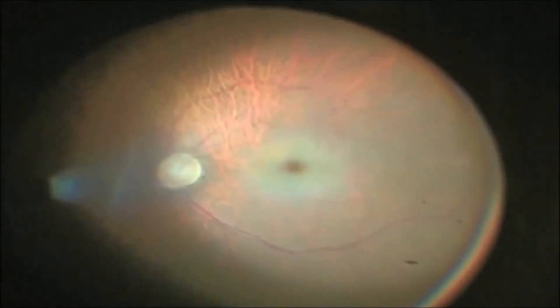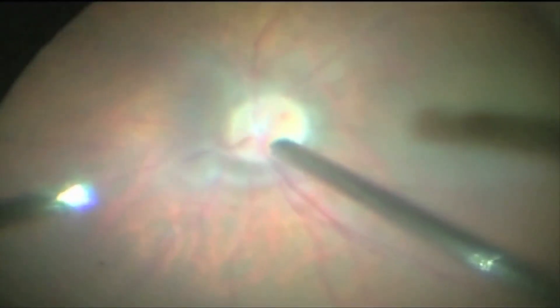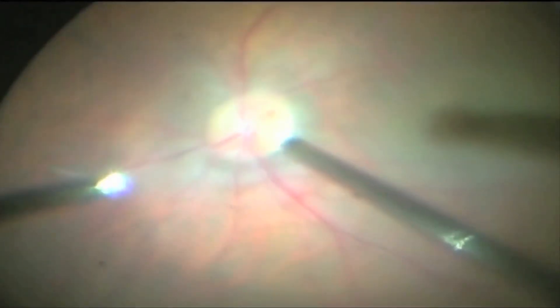The migration of the embolus is dependent on the mean arterial pressure. In patients with a low mean arterial pressure, the embolus shows a slow migration. However, in many cases it moves through the retinal circulation very rapidly. Like this eye with a CRAO, once the vitrectomy and disc massage was done, the central retinal artery can be seen pulsating to life instantaneously.